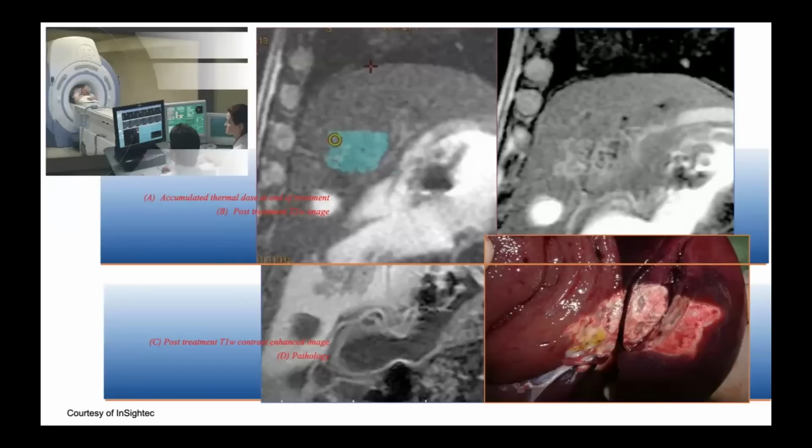Now, there are different technologies, but similar things. So this is HIFU, or high-intensity focused ultrasound. Again, this is a thermal ultrasound, utilizing ultrasound to oscillate the molecules to cause friction heat at the site. And you can see this is a porcine liver, and that's the ablation mark that got done by this technology, which is available and is currently under a lot of study.